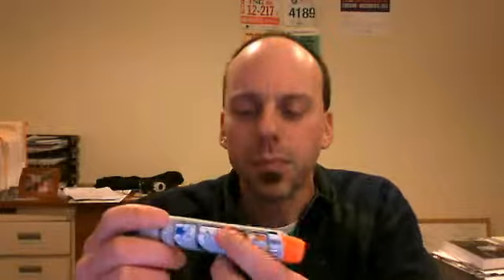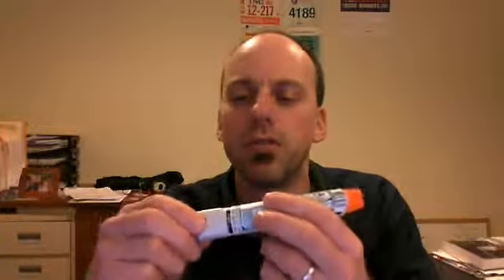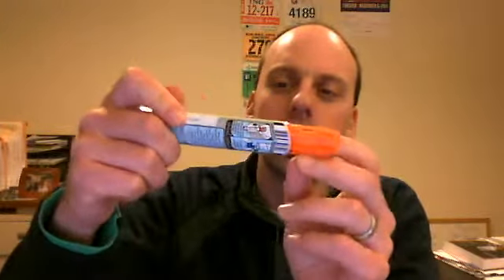First of all, EpiPen. This is an EpiPen trainer — there's a new type out. You just remove the blue cap and then press this orange tip against the lateral aspect of the patient's thigh. Maybe you heard it click, but when you withdraw this thing, the orange tip covers it, so the needle would actually be sheathed in there.